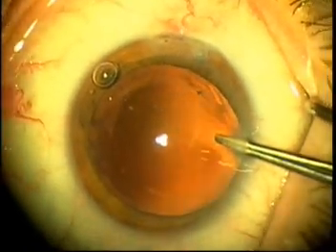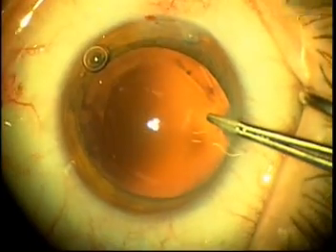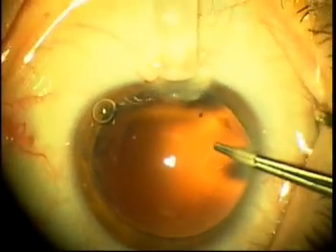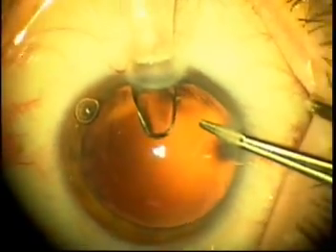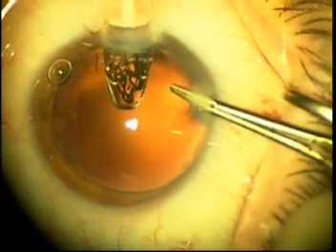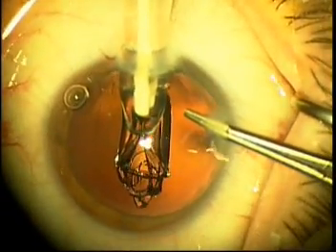The incision here is enlarged from 1.8 mm to 2.8 mm and the Acreos lens injector is placed into the anterior chamber and it is aimed somewhat steeply posteriorly. The lens is initially injected and allowed to unfold slightly and what you will notice is that about halfway through the injection the lens starts to come somewhat anteriorly and at this point you stop injecting forward.